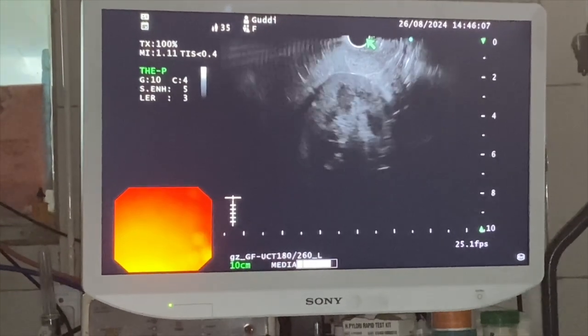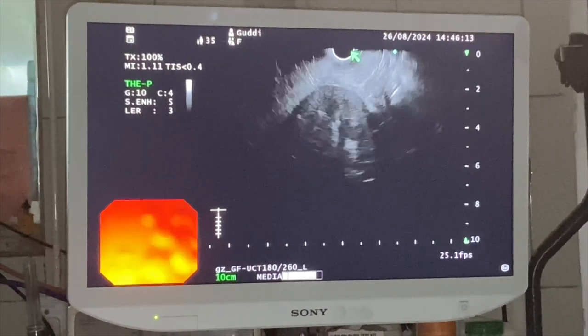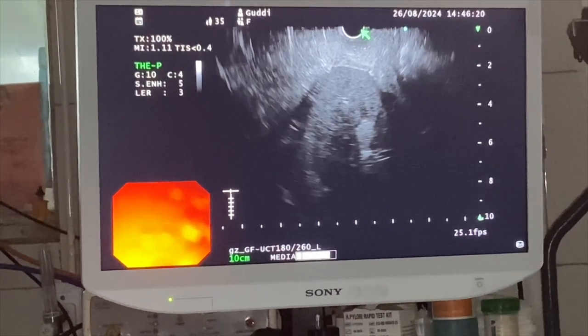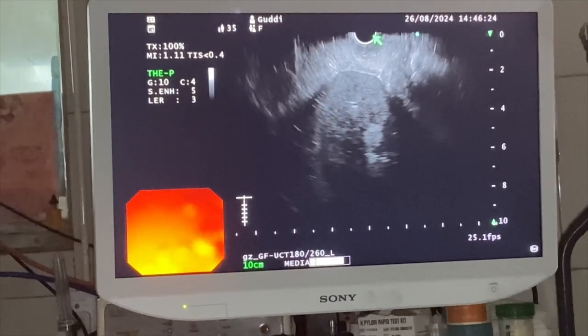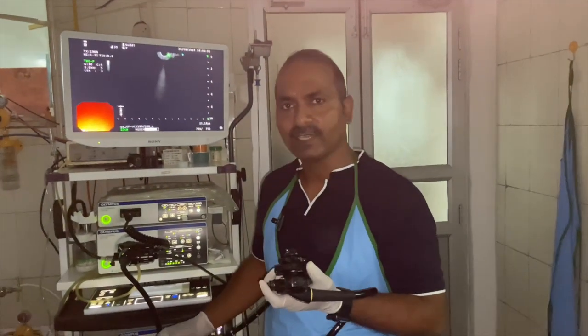So from the second portion of the duodenum, you can easily identify the segment 6, and all the pathologies, whether be the liver abscess or the metastasis, you can accurately localize in the liver segment. So friends, in today's presentation, we have demonstrated the various liver segments.